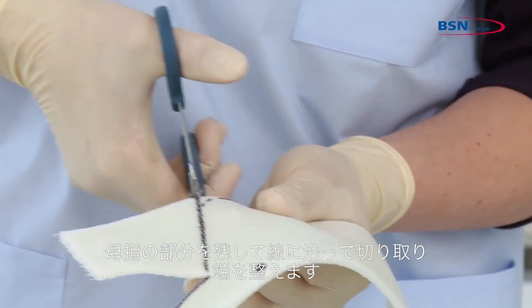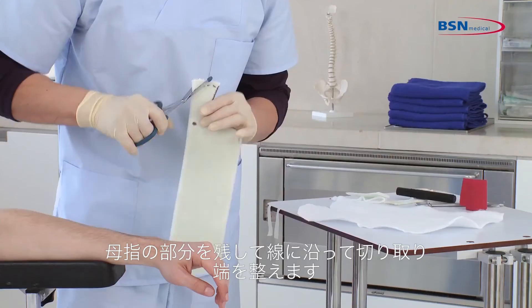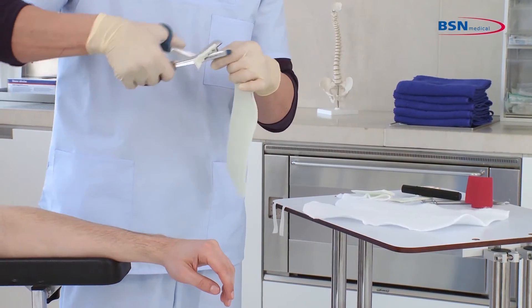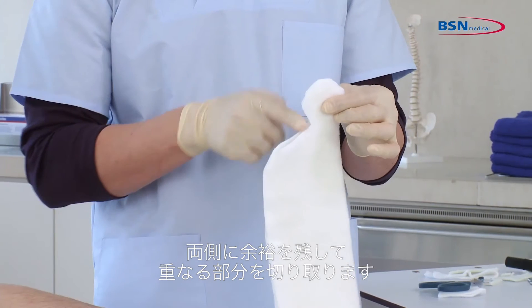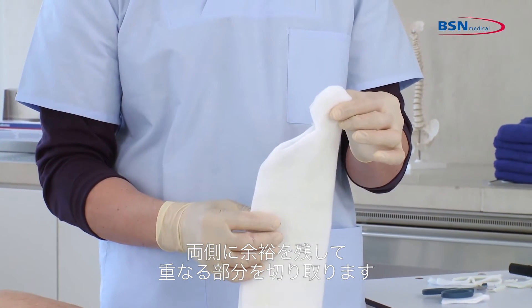Cut out the shape, leaving the thumb portion, and round the edges. Trim the overlapping padding, leaving a margin of padding on either side.